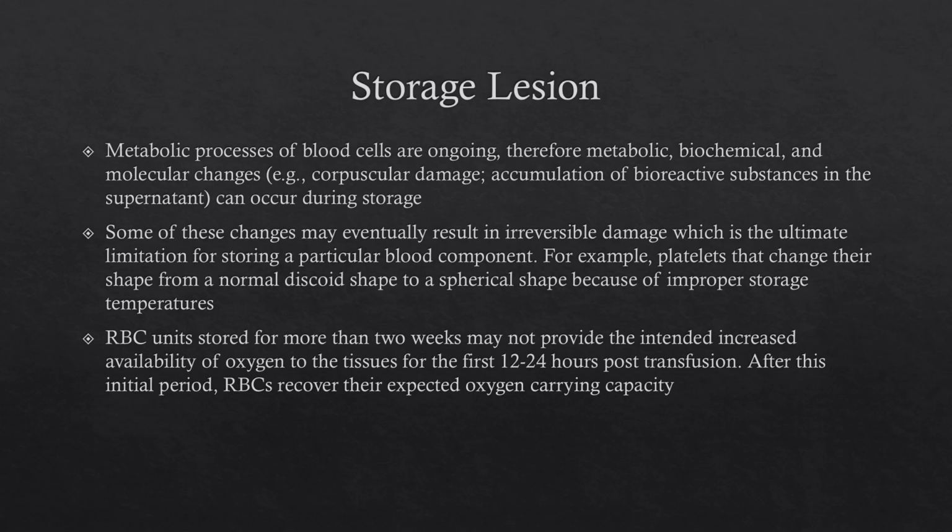So there are requirements that may be requested, as in a fresh unit for, say, pediatric uses or sickle cell patients, to avoid the drawbacks that we experience with the storage lesion.